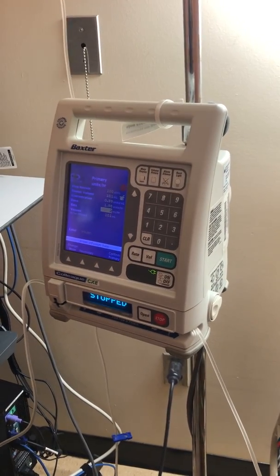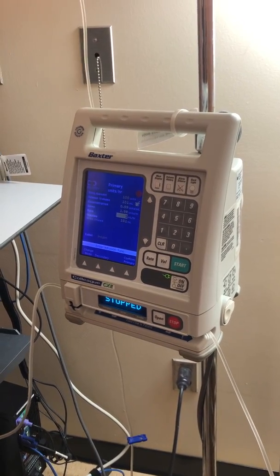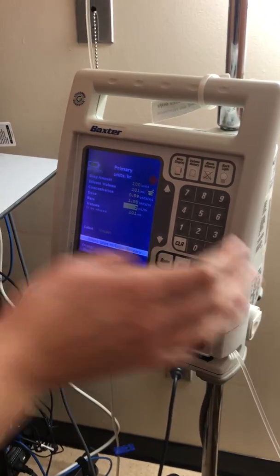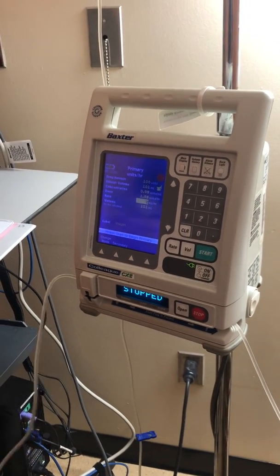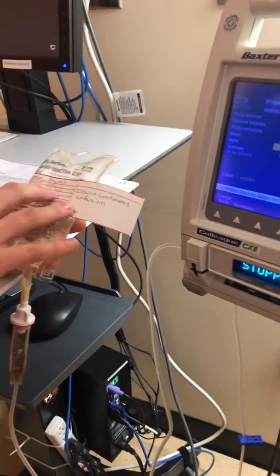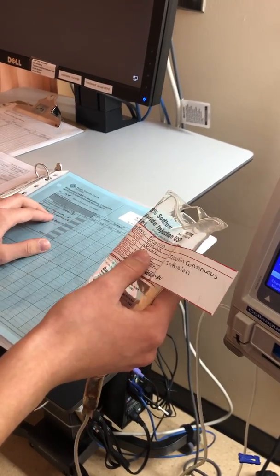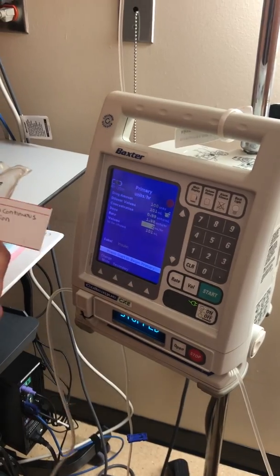That is good. So then we're going to confirm the primary. And now we're going to do the second check. So we have right patient, Bryson Scotland. We have right drug, insulin, Humulin R. Right dose is 100 units at 2 units per hour.